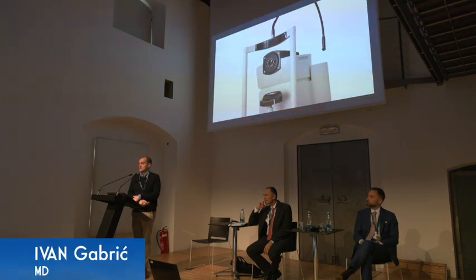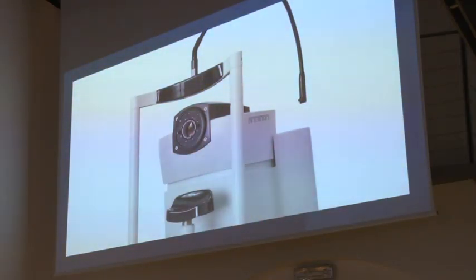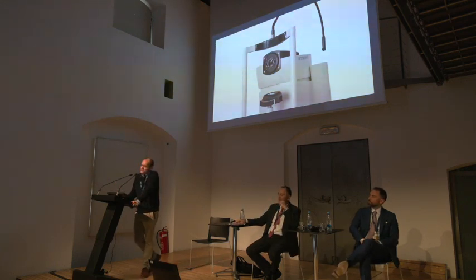Then we have the, well, think about this. This is an anterior segment OCT, an amazing device. What are those things on top? Those are little LEDs. Do you know what the LEDs are used for? Keratometry. So we have a €100,000 device which is doing 64 slices of the cornea and making amazing quality maps and diagnosing keratoconus, but when it comes to simple IOL calculations, it needs the LEDs for keratometry.